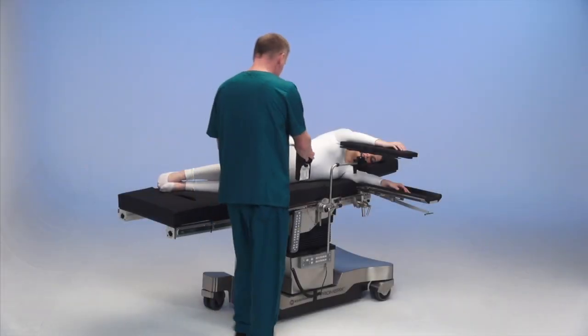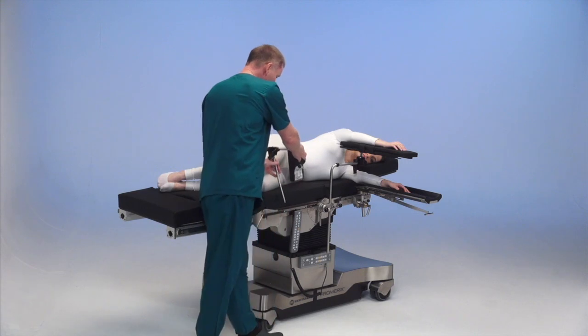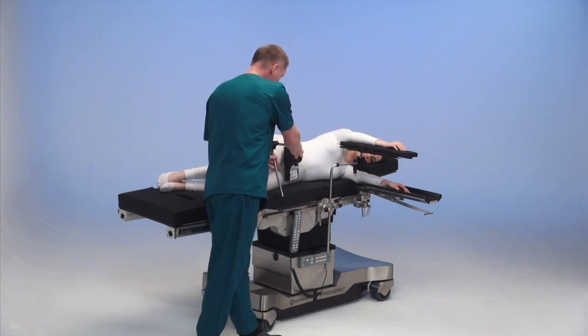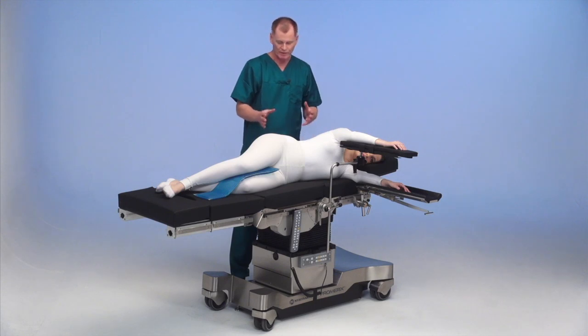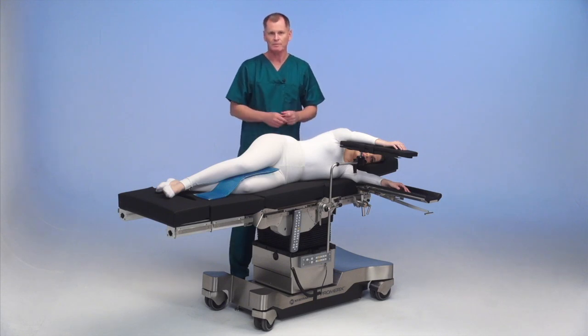Lateral positioners can be placed on the table using a side rail clamp and positioning it against the hip. Padding should be placed against the bony prominence of the knee and/or the ankles. At this point, we're ready for total hip.